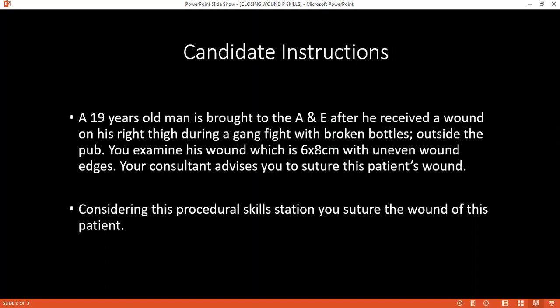Today, I will confirm the name and age of the patient. May I know your name and date of birth, please? I will ask the name and date of birth of the patient.